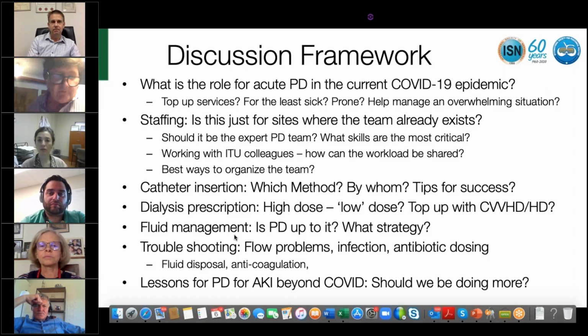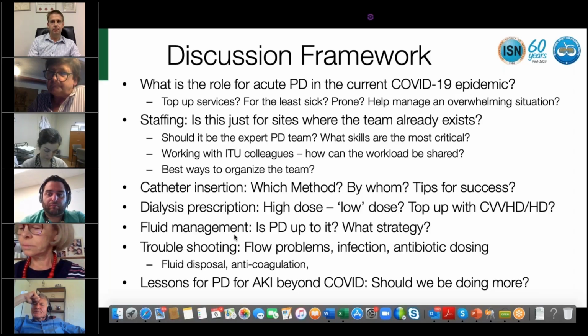So Simon, yes. Fred, can I just point out one thing, which is that in the Brazilian studies where they placed PD catheters in the intensive care unit, they were able to get weekly Kt/V that were over 4, which would be equivalent to what you get with a daily hemodialysis treatment. So you can actually get quite high clearances doing PD, again, using a cycler with hourly exchanges. Again, if you're focusing on small solute removal and you're worried about urea levels, clearances can actually be driven up quite high with PD.